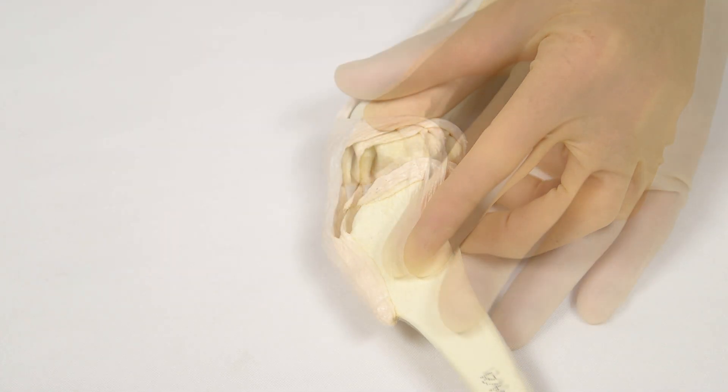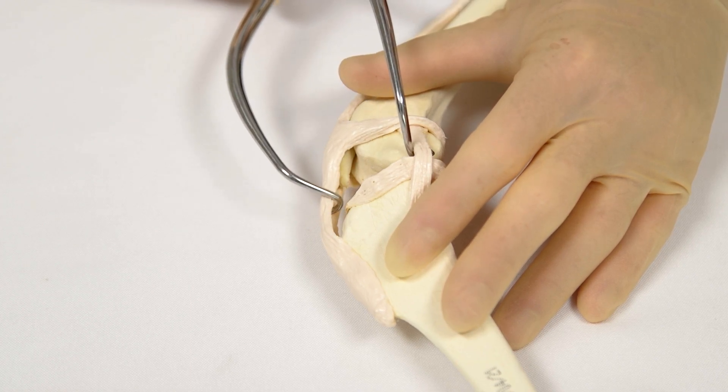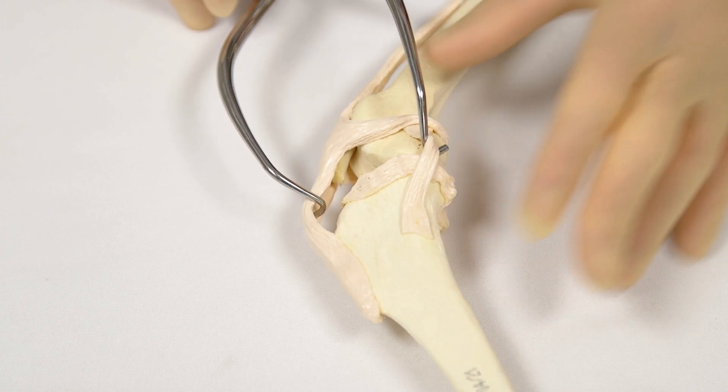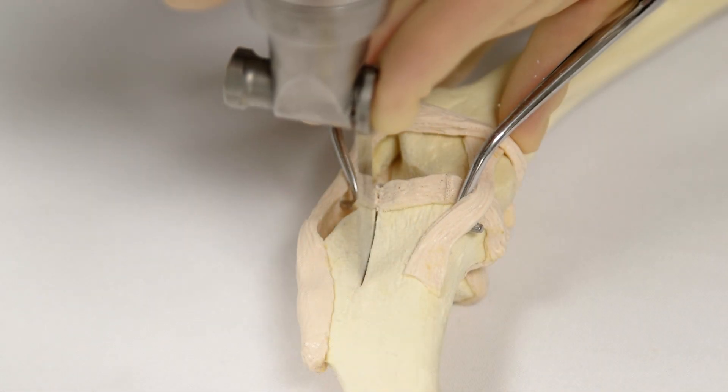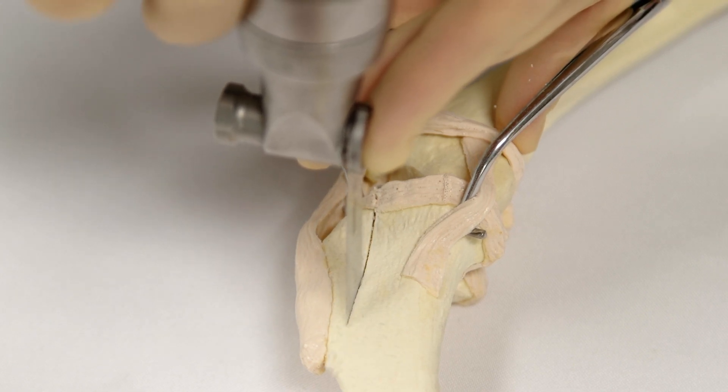Remove the K-wire. Place GELPY retractors in the joint to reflect the patella ligament cranially. This avoids damage during creation of the osteotomy. Use an oscillating saw to make the osteotomy using the prescribed line as your guide.